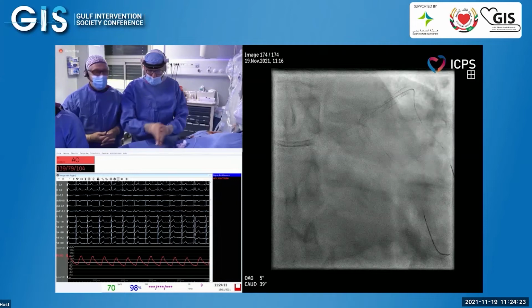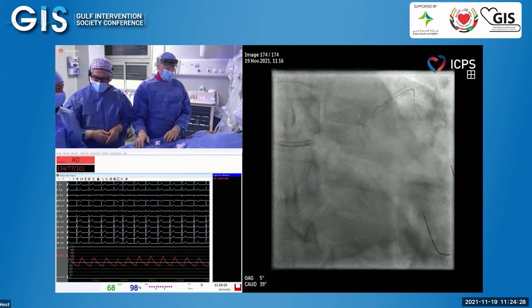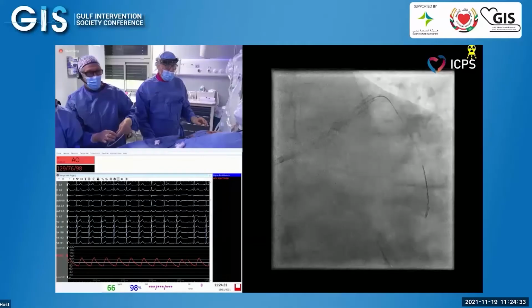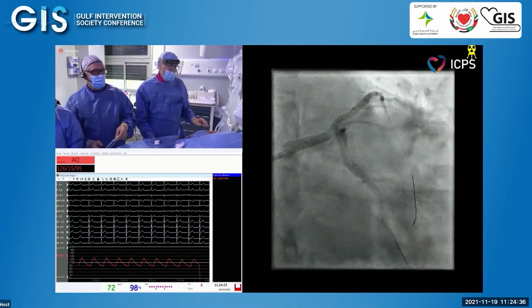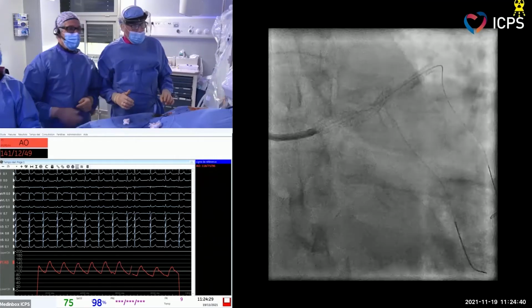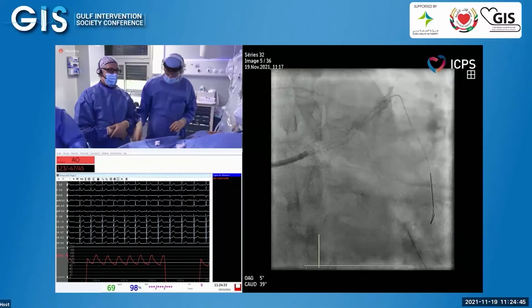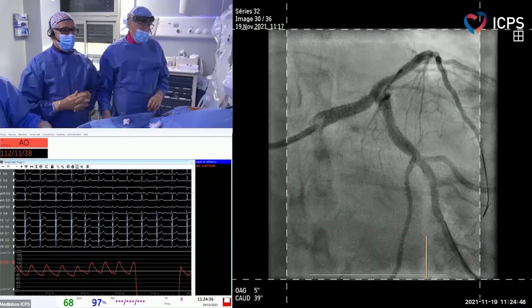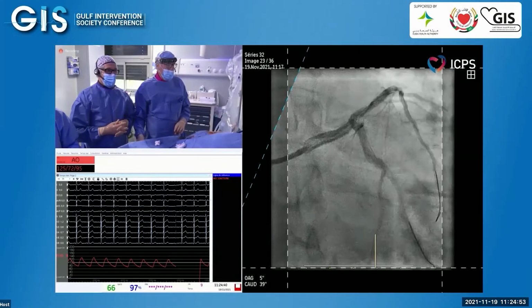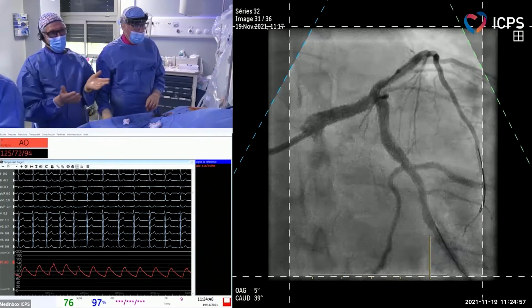I just leave it there, and then if the flow is fine, and I have no problem, you don't open the struts to the circ, unless I have a compromised ostium. That's the only condition where I do a gentle kissing ballooning to create kind of alignment of the carina. But usually I don't do it routinely anymore. Good. Okay. So we have already a good result. I never do it, and I've never seen a problem. But I mean, occasionally there are problems when you dilate the struts, so you have to counterbalance. I don't open the strut unless I need to.